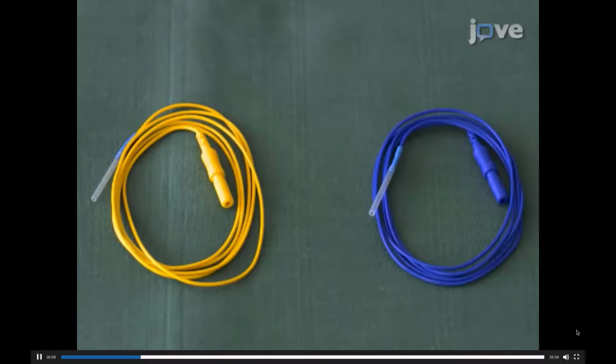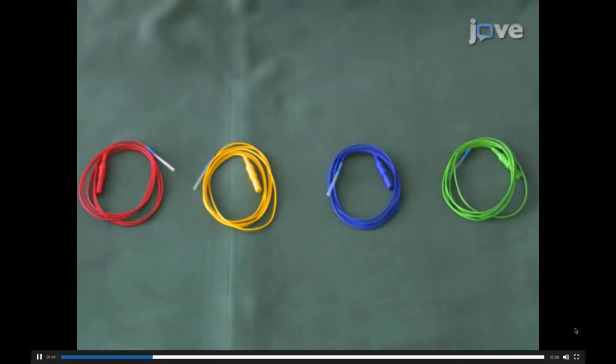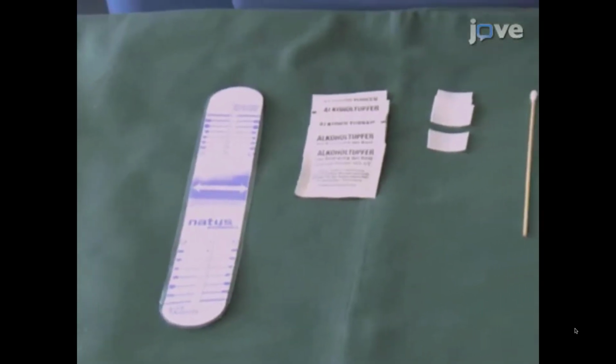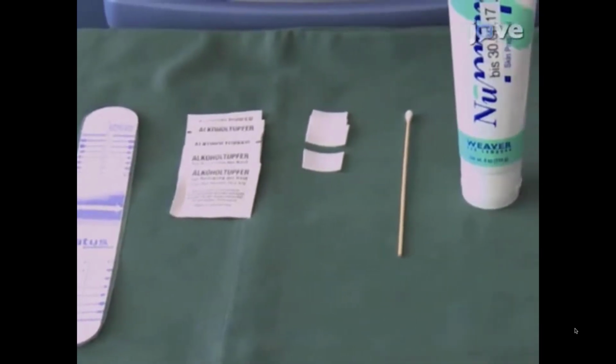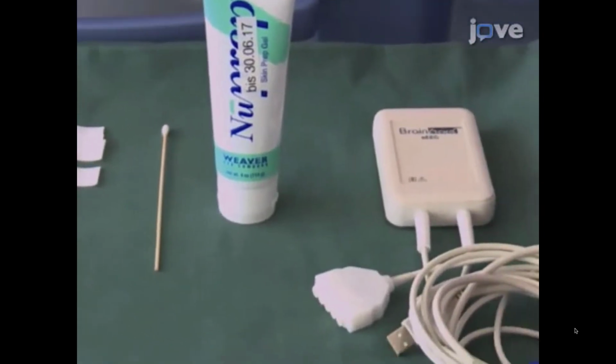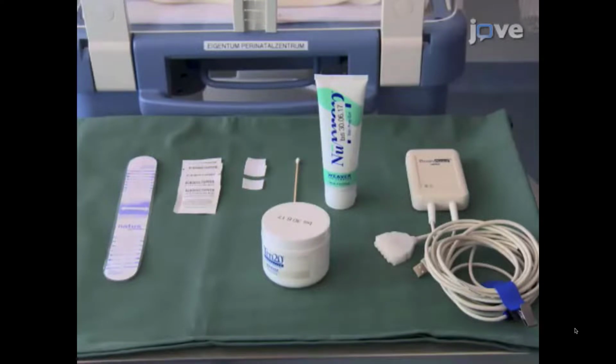Next, collect 2 electrodes for a single channel amplitude integrated EEG, or aEEG, and 4 electrodes for a 2-channel aEEG. If not using needle electrodes, choose the type of electrodes you want to use instead. Prepare a positioning strip, skin disinfectant, tape appropriate for use in neonates, swabs, skin preparation gel, a module box, and contact gel for gold cups.